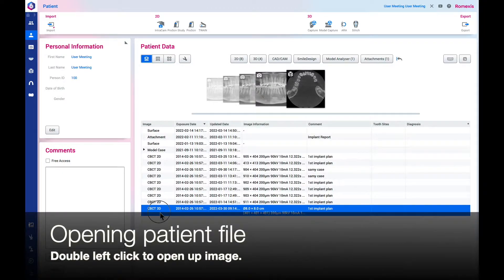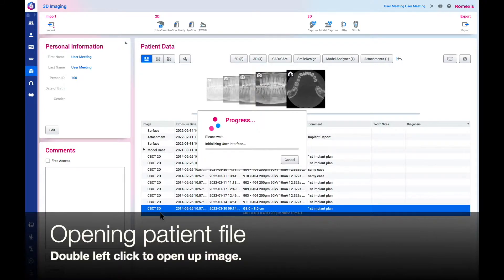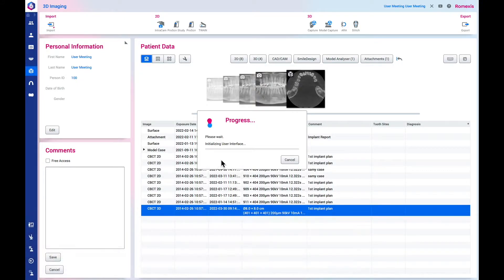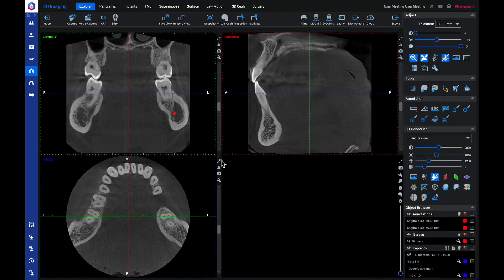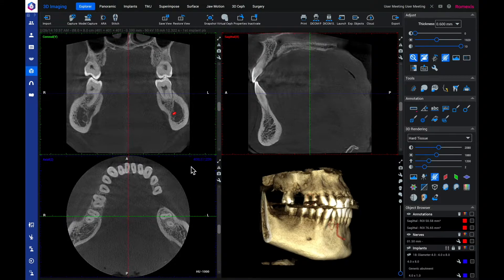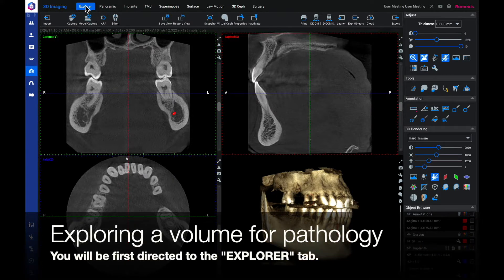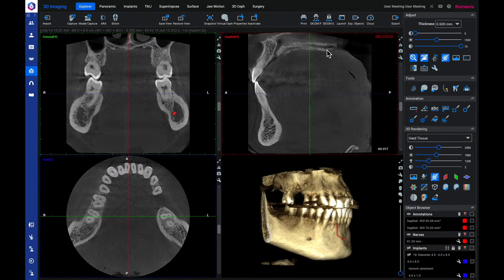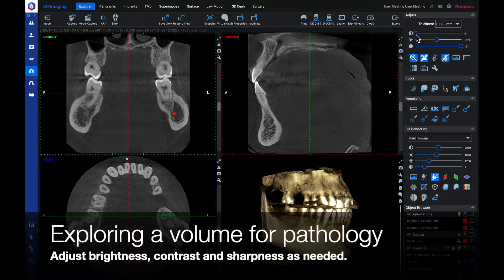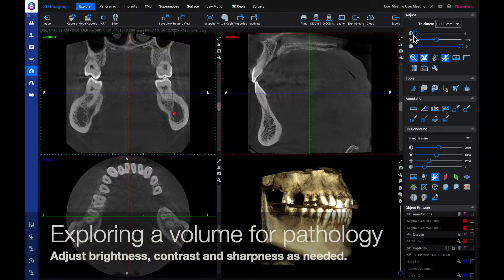Double left click to open up an image. You will first be directed to the explorer tab. Adjust brightness, contrast, and sharpness as needed.